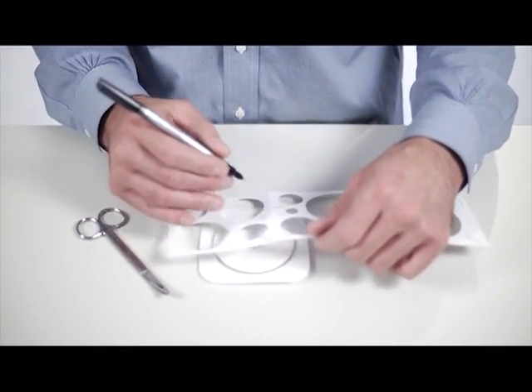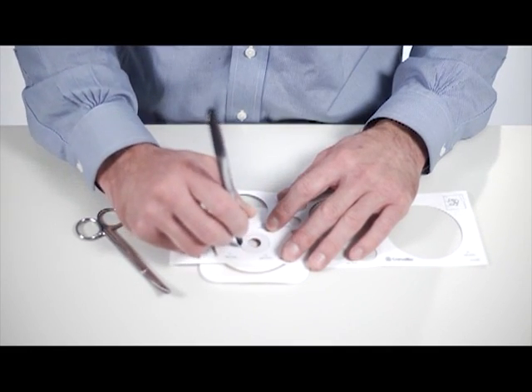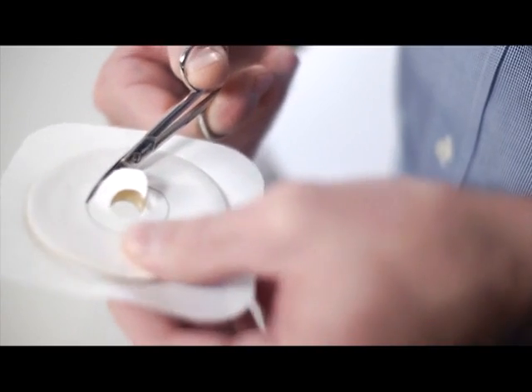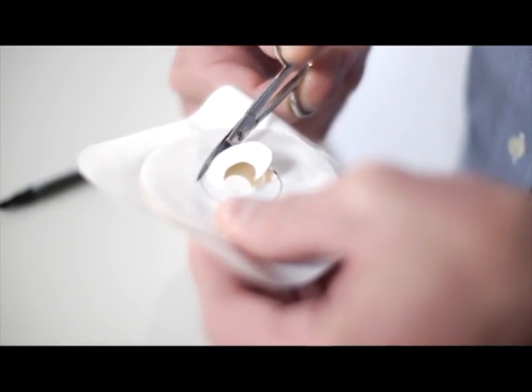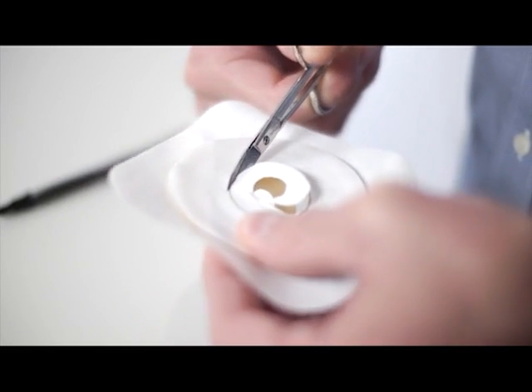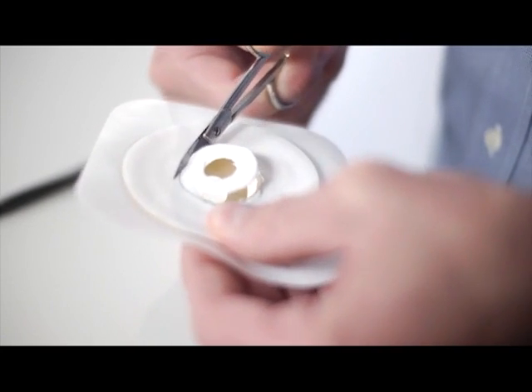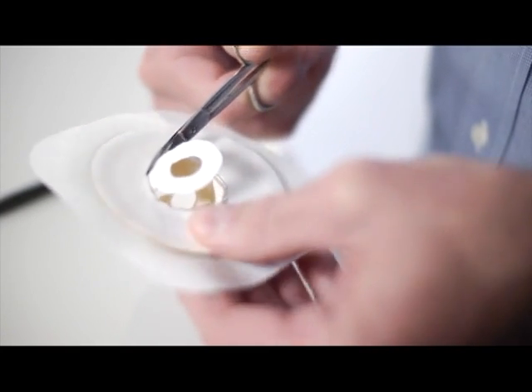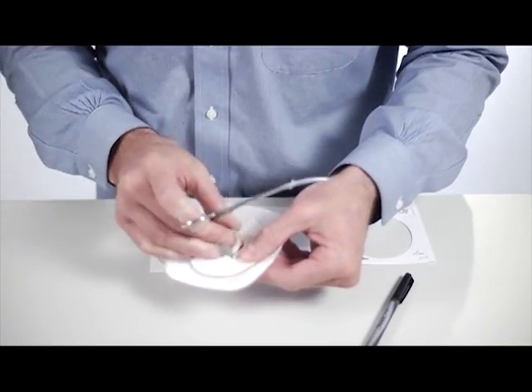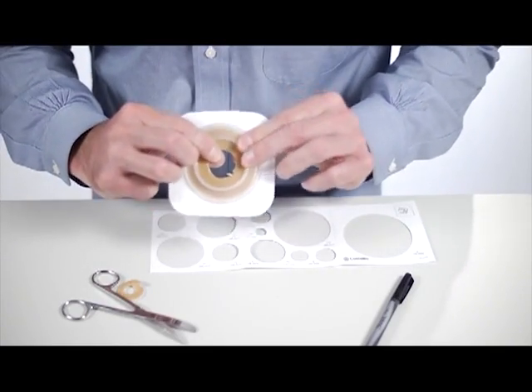To cut your wafer to size, trace your stoma size onto the center of the white release paper on the back of your wafer. Use the scissors to cut along the outside of the tracing. Remember that cutting an incorrect size can lead to leakage and skin irritation. Since your stoma will continue to change over time, getting the closest fit will give you the most effective results. Use paste to fill in any gaps. After you have cut your wafer, use one finger to smooth the inside edge of the adhesive.